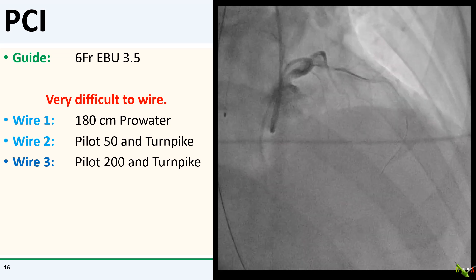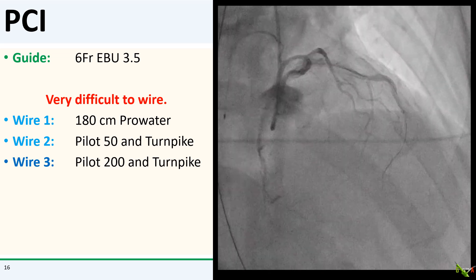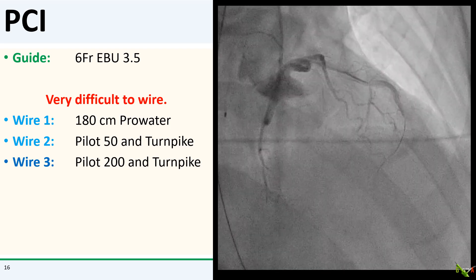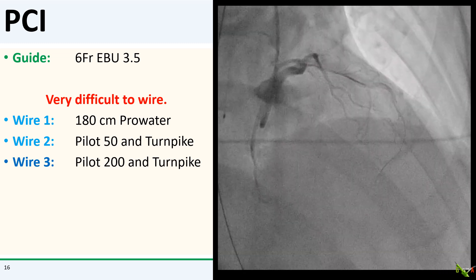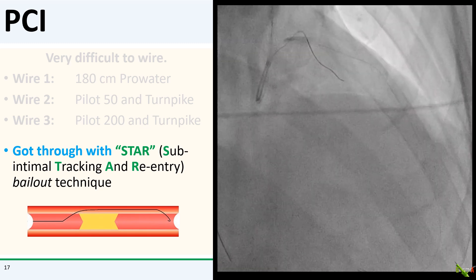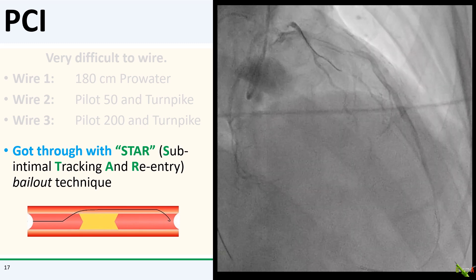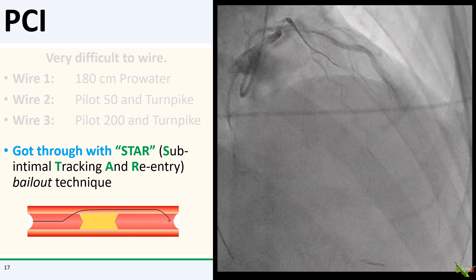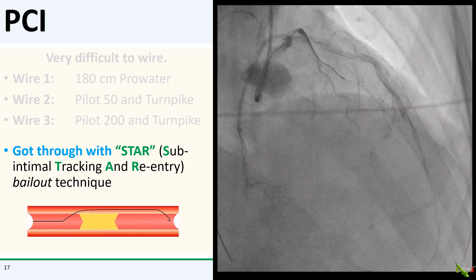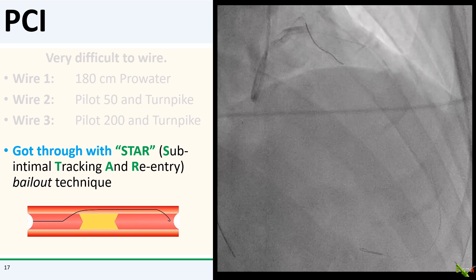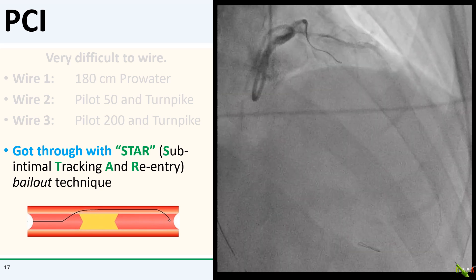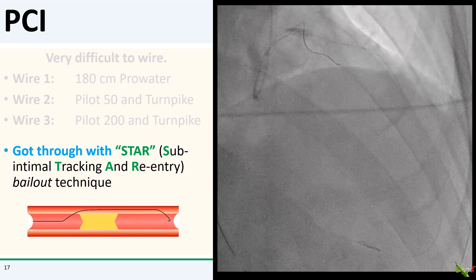This was incredibly difficult to wire. I couldn't get through with a ProWater or a Pilot 50 wire. I couldn't get through with a Pilot 200 wire either, even using a Turnpike microcatheter. I thought my wire was almost certainly in the dissection plane. But the patient was crashing, and I had to get the wire through. So I decided to try STAR — subintimal tracking and reentry. The idea in STAR is that your wire is usually still fairly close to the surface in the subintimal space, so if you keep pushing your wire forward down the vessel, eventually it will pop back into the true lumen. That's fortunately what happened. I was able to STAR my wire down the LAD, and it probably went back into the true lumen in the distal LAD. You can see the long dissection in the mid-LAD, and maybe thrombus or more dissection in the distal LAD.